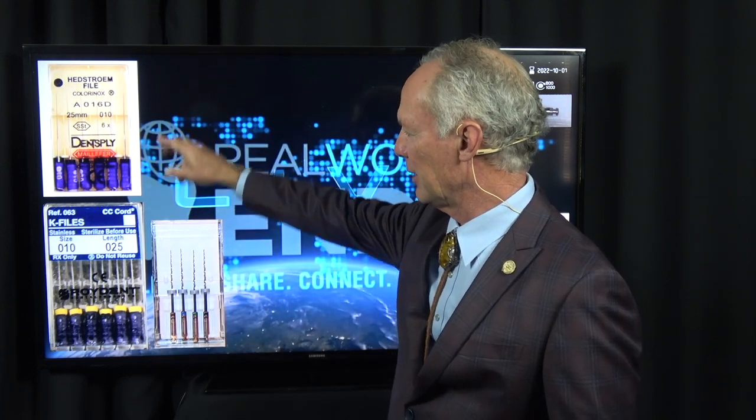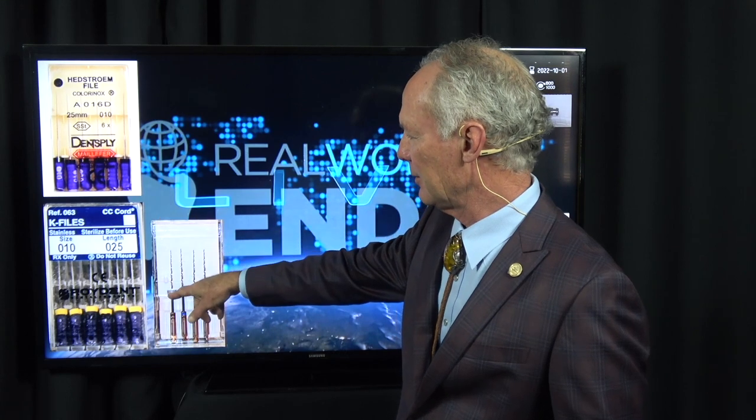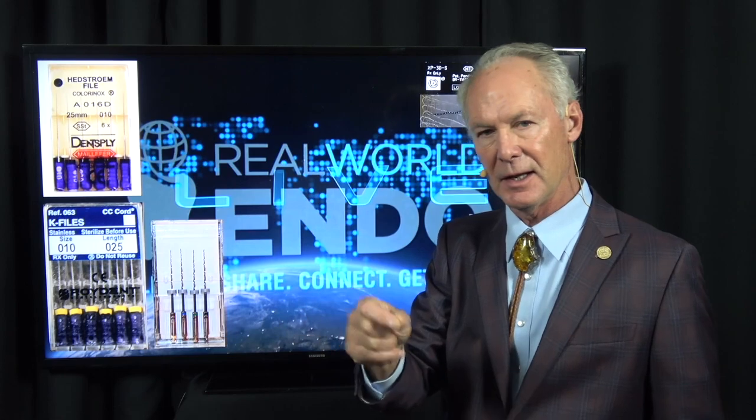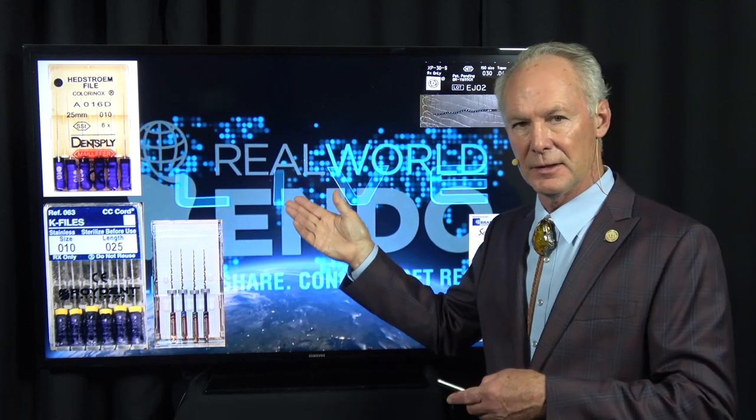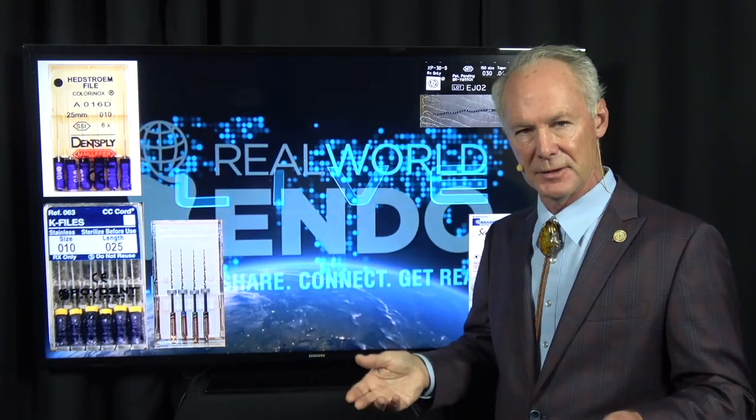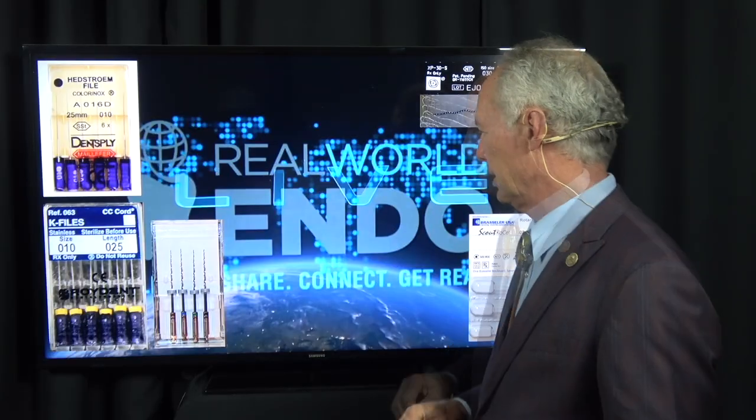I like Hedstrom. A lot of people use K files, and this is a size 10, and you clean that out really well. I irrigate with 3 parts water, 1 part sodium hypochlorite. A lot of endodontists use straight sodium hypochlorite. I've had very good luck with 3 parts water, 1 part sodium hypochlorite, and there's just not the risk if something significant went through the apex of the tooth.